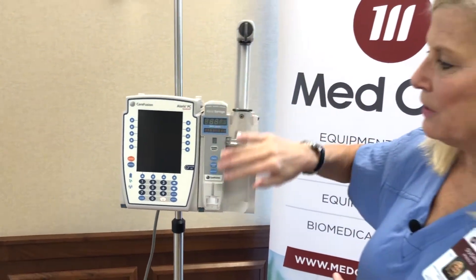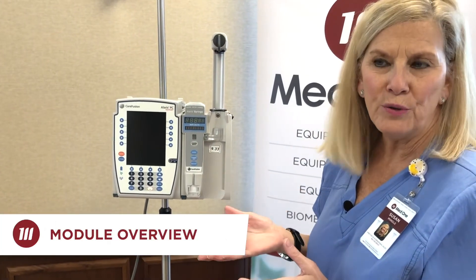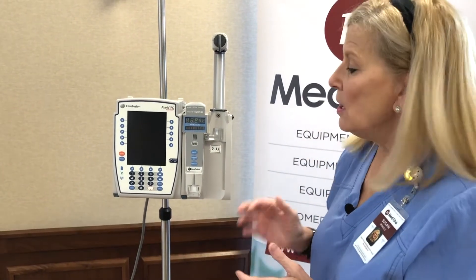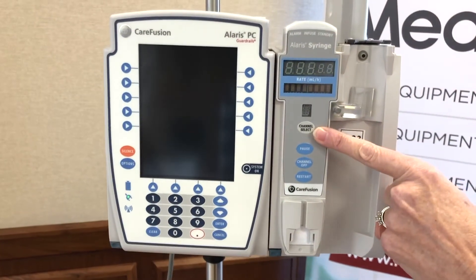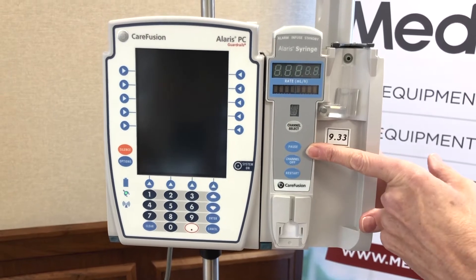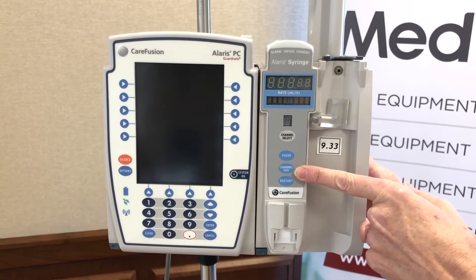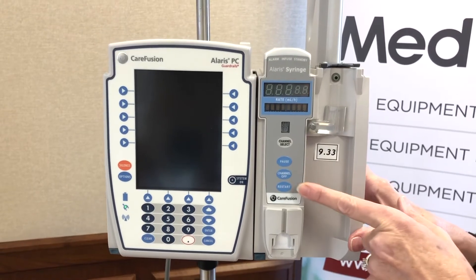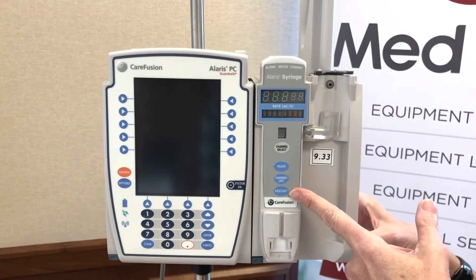Each of the Alaris modules will have the same buttons no matter which ones you choose to bring into your organization. They'll have a channel select button, which is how you activate that module for use. You have a pause button should you need to pause the infusion, a channel off button when you're ready to discontinue an infusion, and a restart button should you have paused something and are ready to restart it.